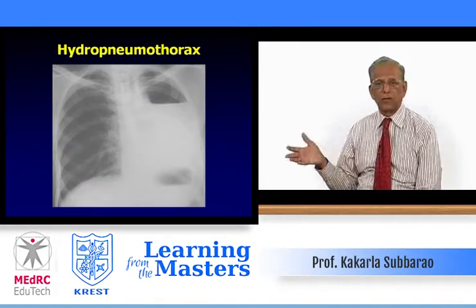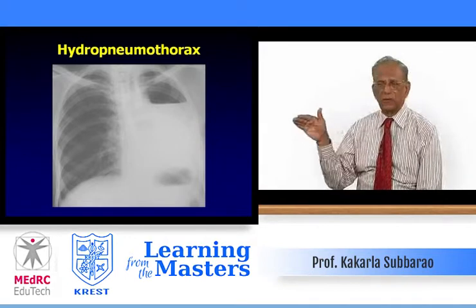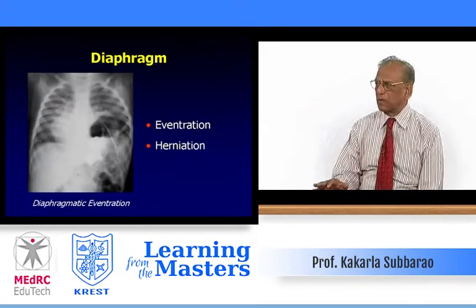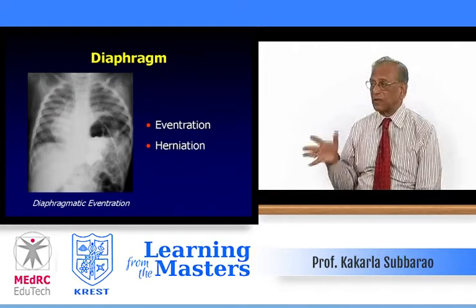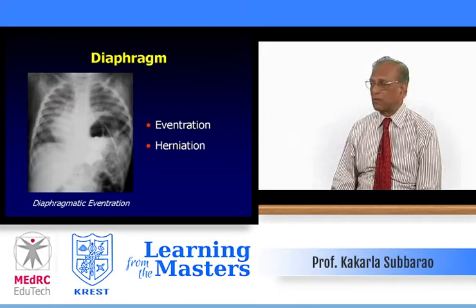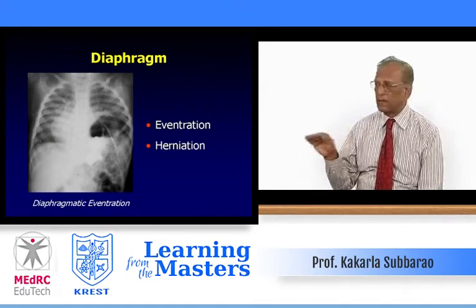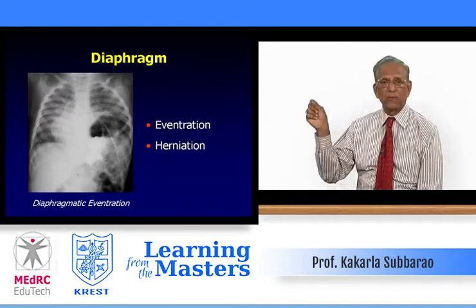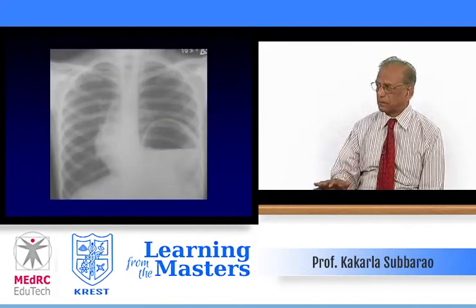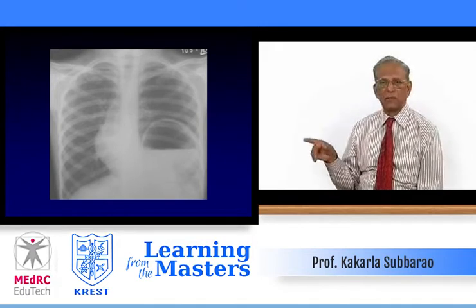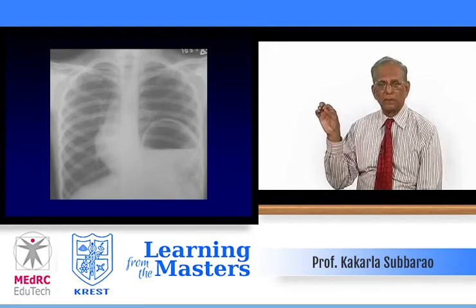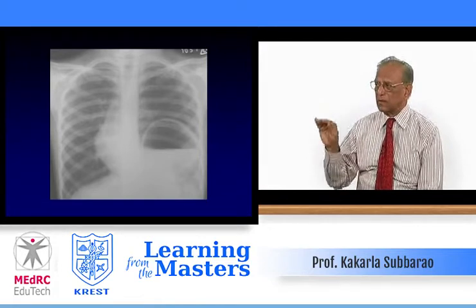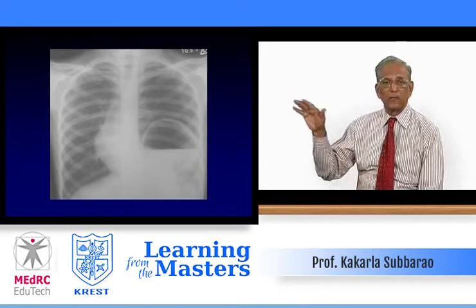Sometimes hydropneumothorax or pyopneumothorax is loculated with an air-fluid level on the left side — simple diagnosis. This should not be mistaken for eventration or herniation through the dome of the diaphragm. Eventration of the diaphragm: the left dome is elevated, heart slightly shifted, and the stomach air bubble is high — classical eventration. But in the differential diagnosis, a strangulated stomach through a traumatic diaphragm hernia may look the same. Another classical example of eventration shows the thin diaphragm and the stomach bubble with its superior border almost simulating the diaphragm.